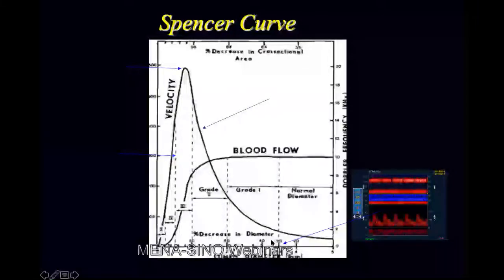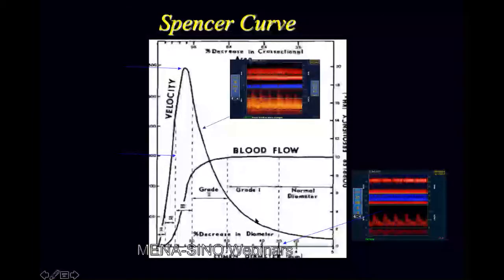What happens in the presence of intracranial atherosclerotic disease, vasospasm, vasculopathy, or any form of vascular narrowing, like cocaine-induced vasculopathy, intracranial atherosclerotic disease, or intracranial arterial dissection that leads to arterial narrowing, all these forms that decrease the lumen diameter? At that stage, the velocity increases to maintain the blood flow in a normal range.